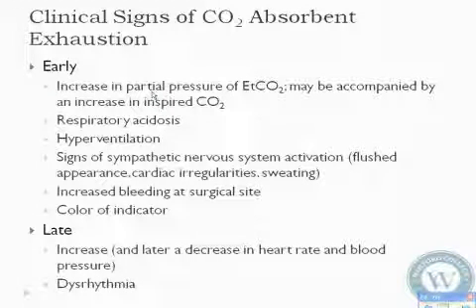They can get very flushed. You can get some cardiac irregularities. They can definitely begin to sweat, and you will see that. They'll just become drenched. Increased bleeding at the surgical site, and of course, the CO2 granules can turn purple. Late signs are a change in heart rate, change in blood pressure, and then significant cardiac dysrhythmias.